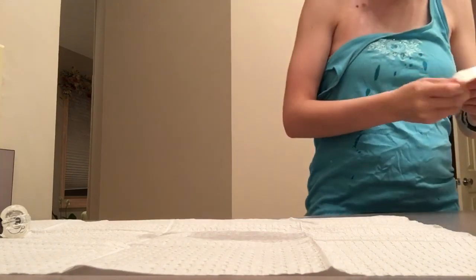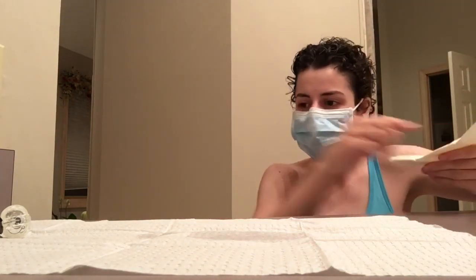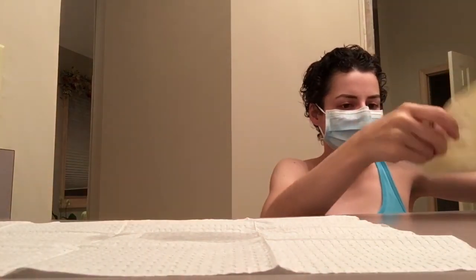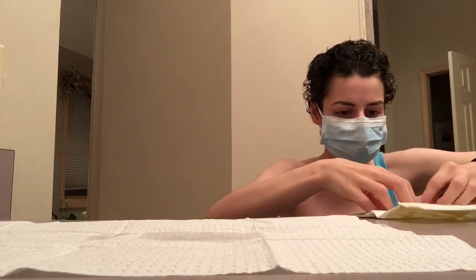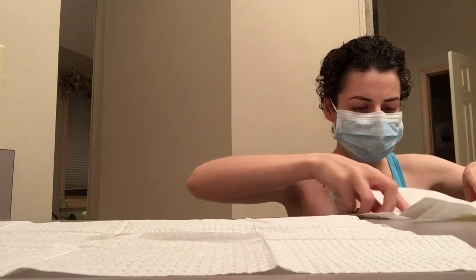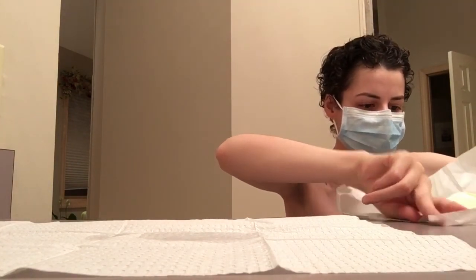Now, throwing that stuff in the sink, I'm going to put on my sterile gloves, and then it'll be cleaning time, and then time to put in my needle, and then I'm done. You want to make sure you do things right, but it really isn't a lengthy process once you get used to it and you get good at it.